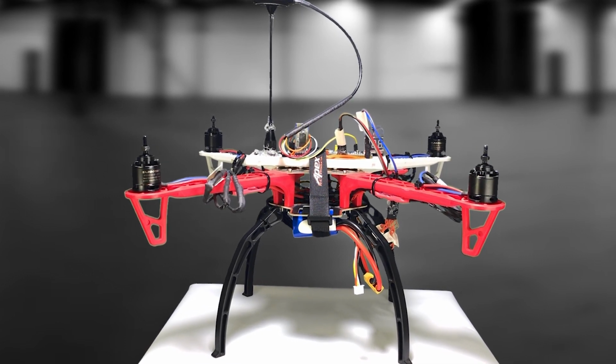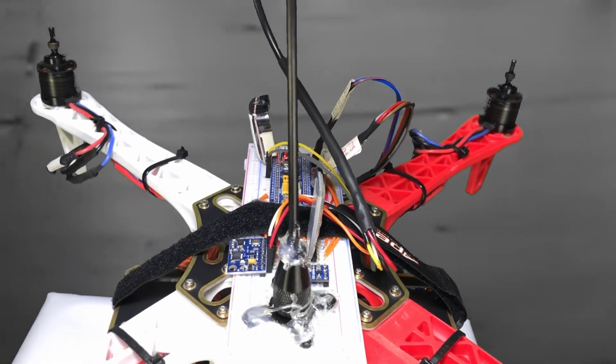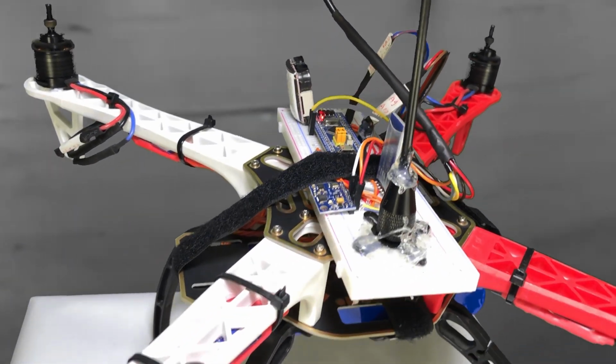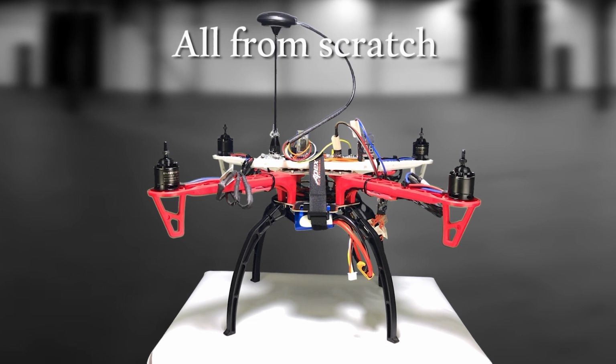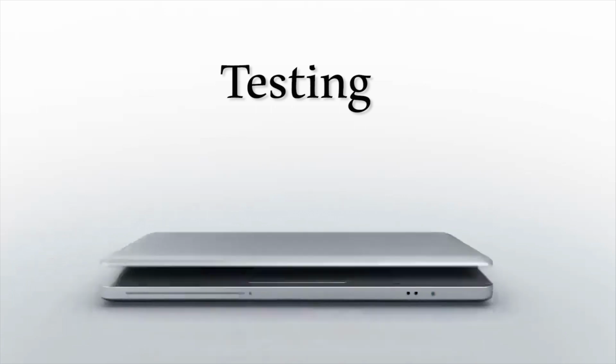Making a drone was not simple. That is why it is important to be organized and follow a cohesive plan to attain the required outcomes, all from scratch. Our plan is divided into 3 main stages: getting accurate readings from the sensors using Kalman filter, controlling the motors using PID controller, and finding the shortest path using 3D motion planning. After successfully implementing the drone, comes the testing part.